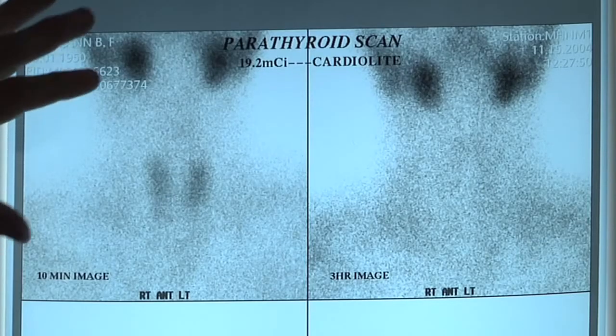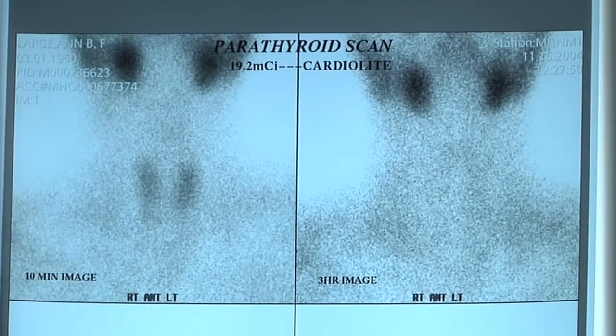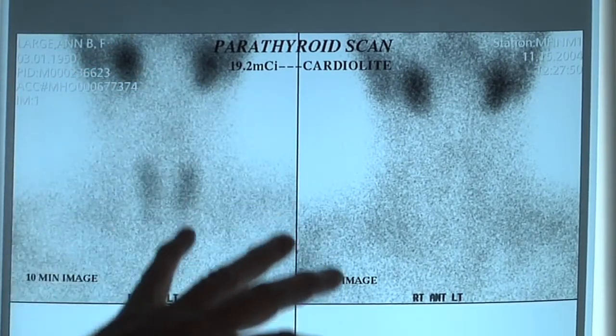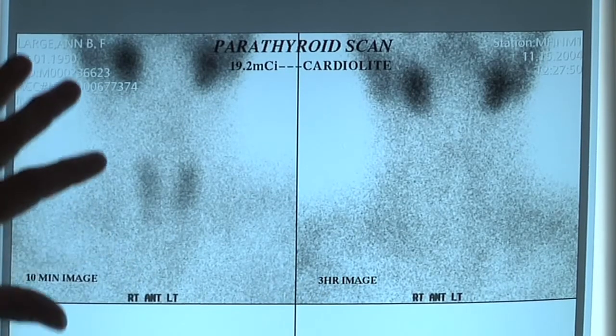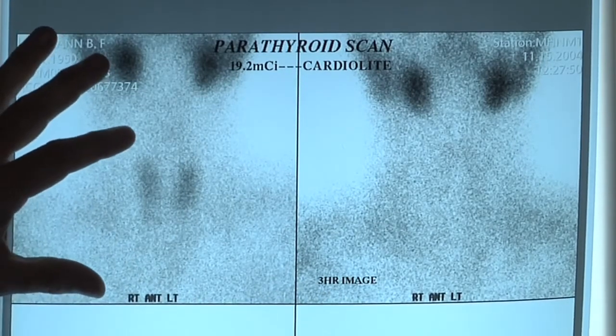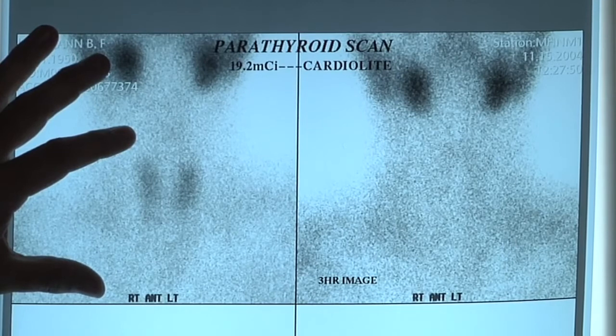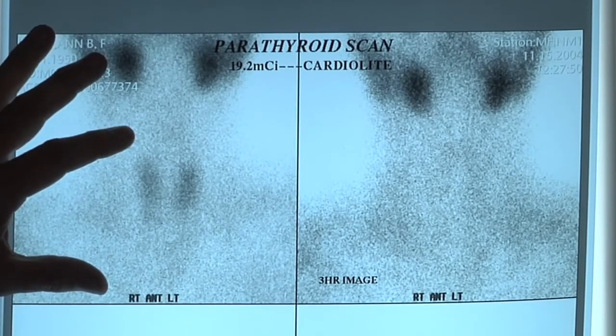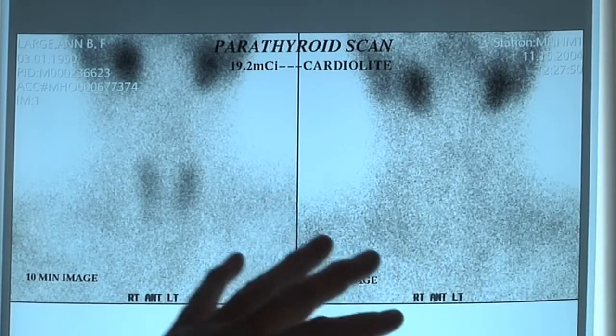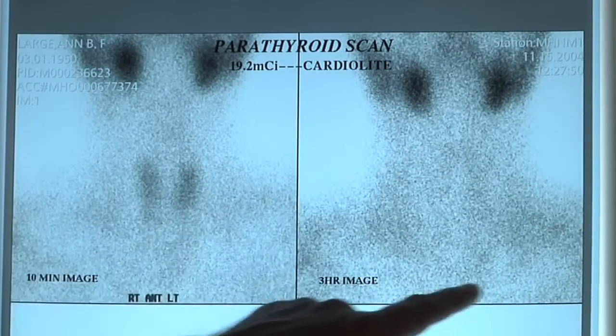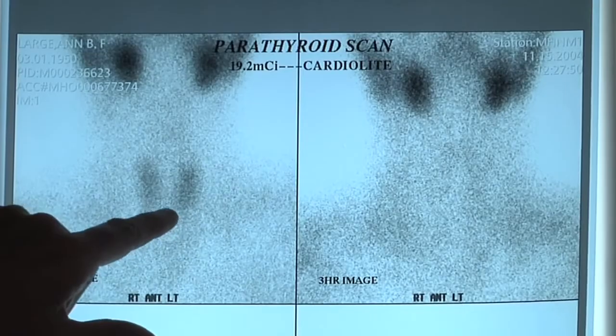The first example we have is this scan right here. Scans should be very clean, crisp, and in focus. This particular patient came to us after already having a failed parathyroid operation. They had an operation that took several hours, didn't find the parathyroid tumor, and this is the scan that she had prior to her first operation. Notice it's blurry. It's not in focus. You can't even really see the thyroid gland.